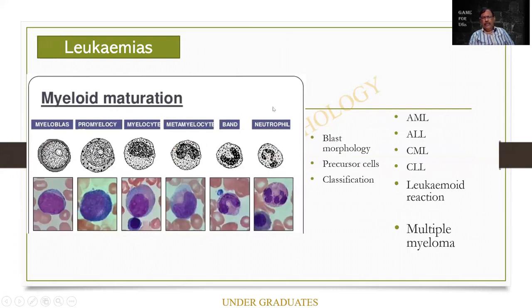Maturation, because I use this as an exercise. I ask a student to draw a picture of a myelocyte, a myeloblast, a promyelocyte, etc. It is not very difficult. I have done it n number of times, and I'm repeating it again.